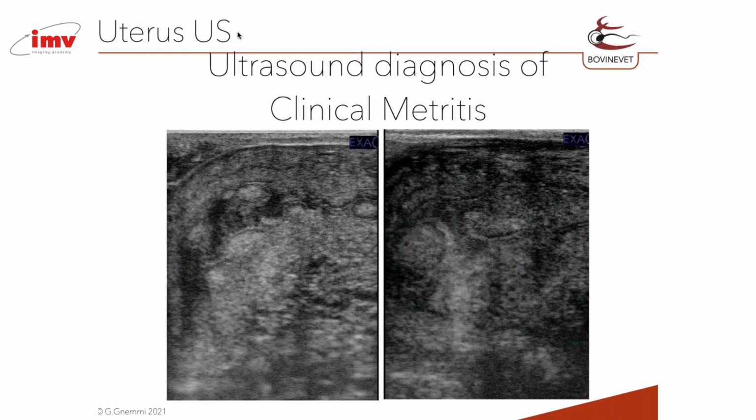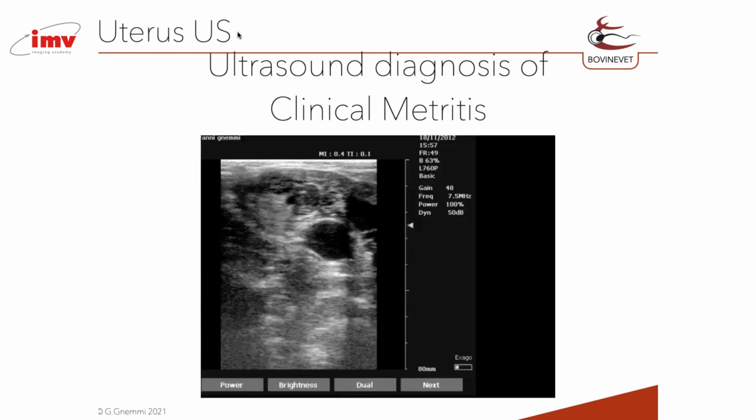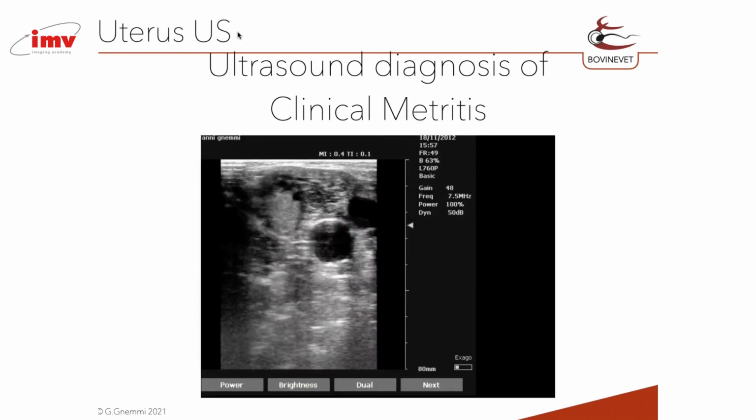I use this type of exam, ultrasound exam, also to evaluate the presence of corpus luteum. In regular cows, normally between day 7, 8 after the delivery, we have the first recruitment, and normally we have the first ovulation in 99% of the cases without estrous signs around day 13, 15, because there is the ovulation of the dominant follicle of the first follicular wave.